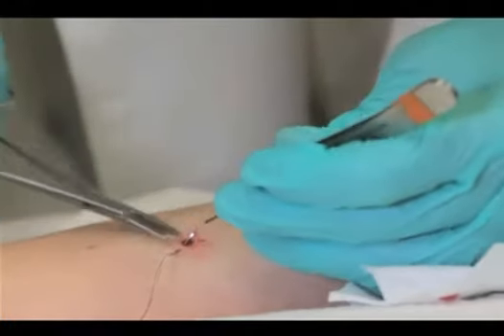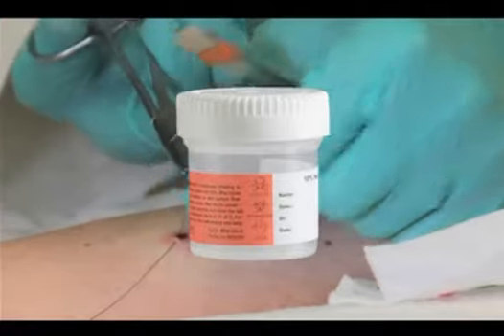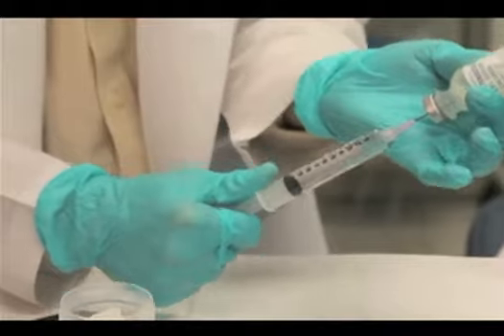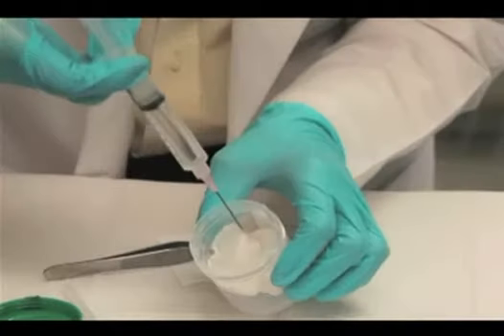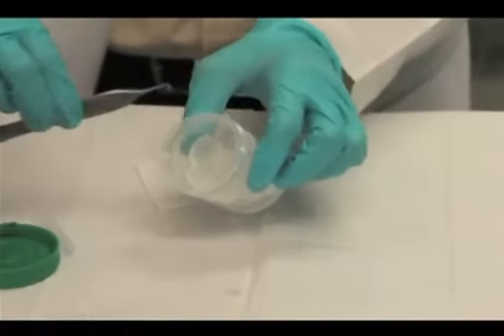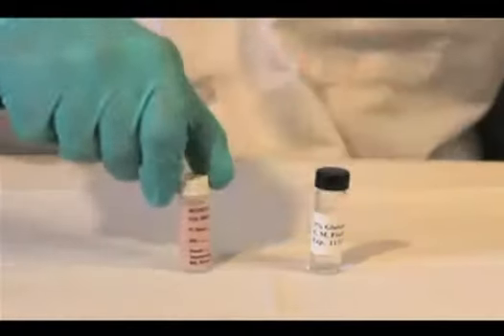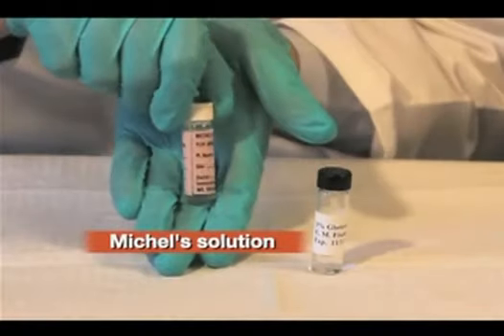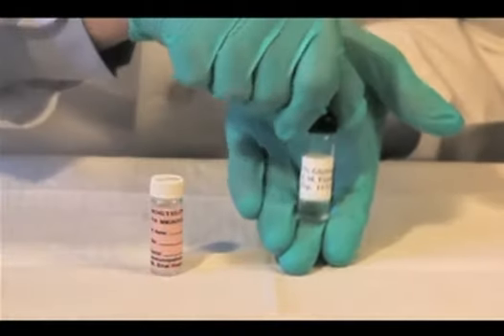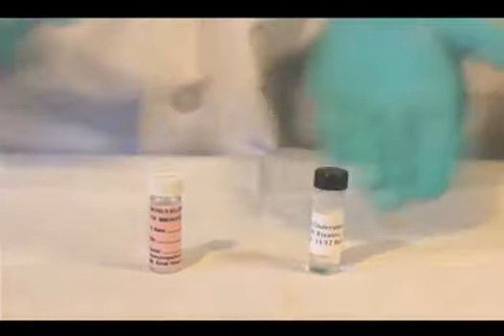The vast majority of skin biopsies are transported in formalin for routine hematoxylin and eosin stain. If a tissue culture is needed, sterile technique should be used. The specimen must be placed on a 2 by 2 inch piece of sterile gauze pre-moistened with 10 cc's of saline that is not bacteriostatic inside a sterile cup such as a urine sample container. For immunofluorescence studies, Michel's solution containing ammonium sulfate is used as transport medium. Glutaraldehyde is used as transport medium for electron microscopy studies.